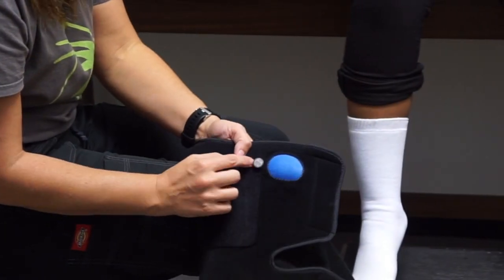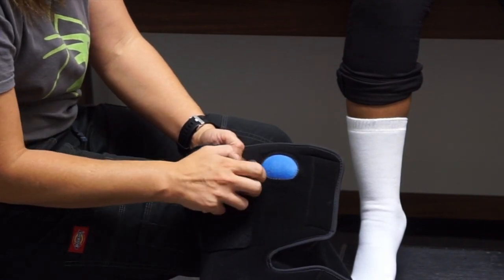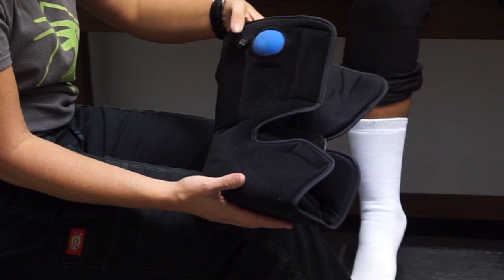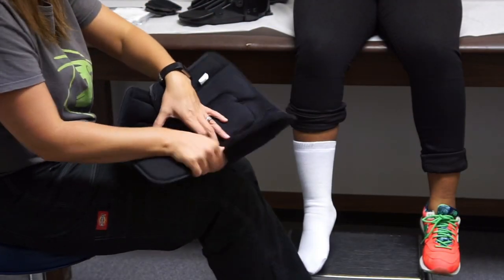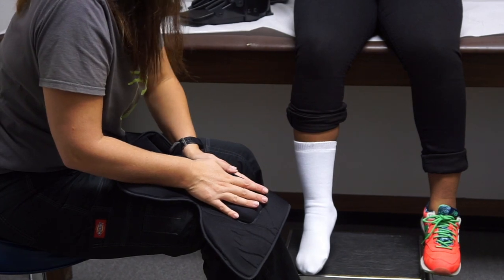The pump itself has an inflate and a deflate option. We're going to always make sure it's fully deflated before we put it on, so that it allows for lots of room and swelling. You can hear how it's letting the air out.